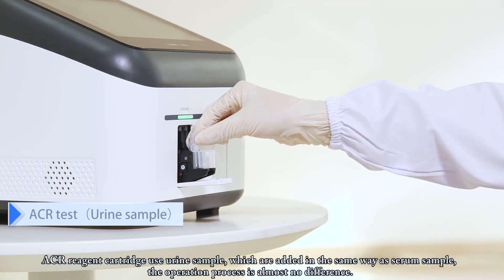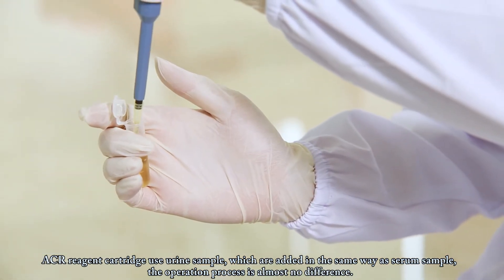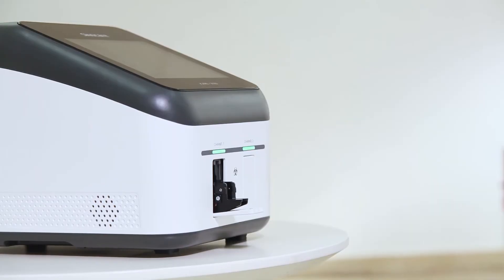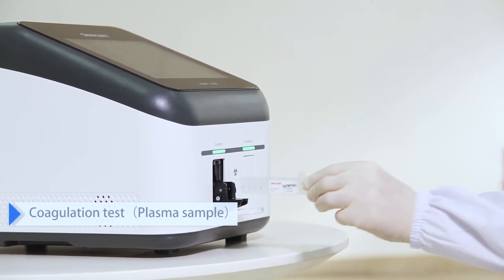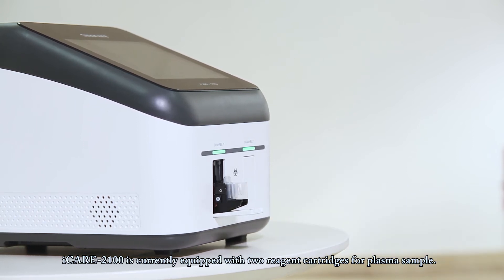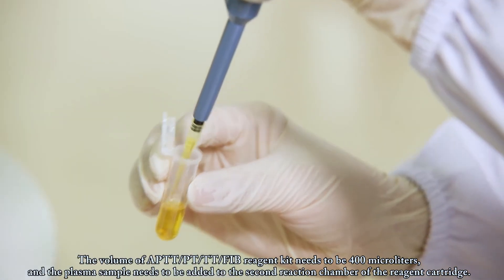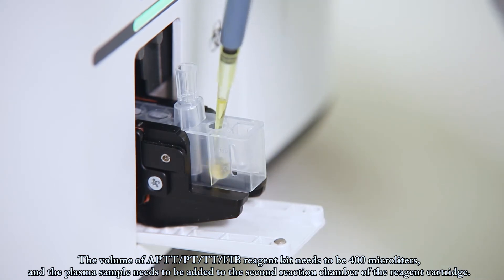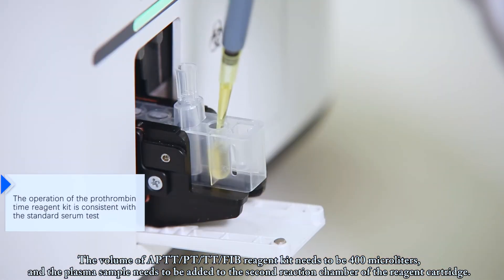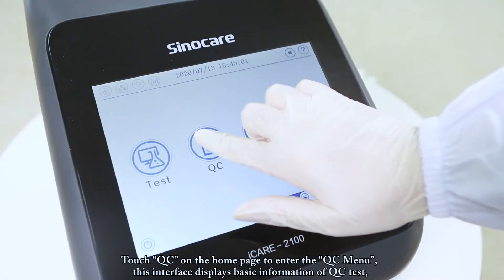For the ACR test, the ACR reagent cartridge uses urine sample, which is added in the same way as serum sample — the operation process is almost identical. For the coagulation test using plasma sample, the volume of APTT, PT, TT, and FIB reagent kits needs to be 400 microliters, and the plasma sample needs to be added to the second reaction chamber of the reagent cartridge.